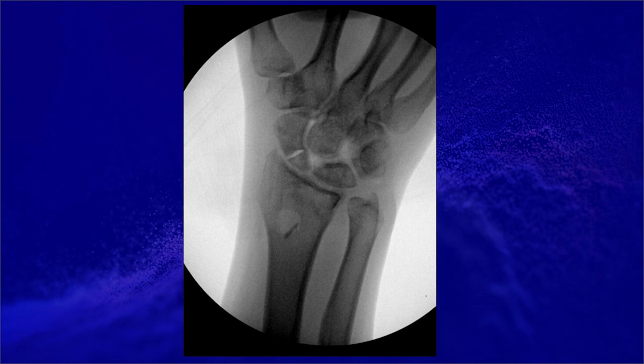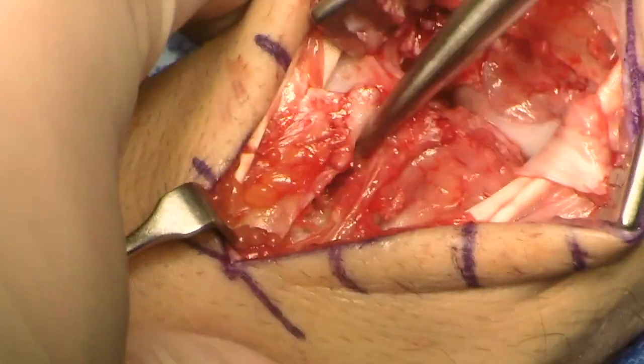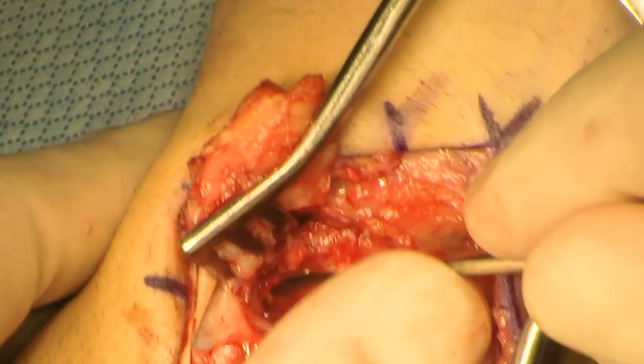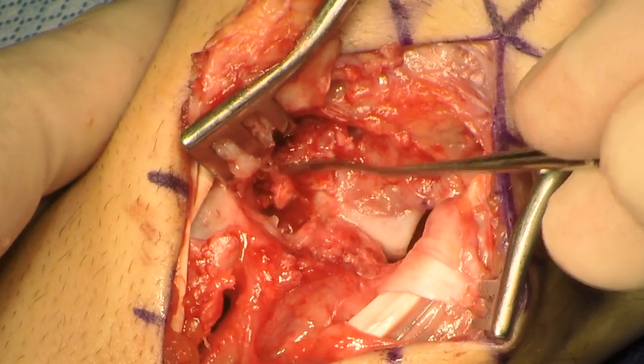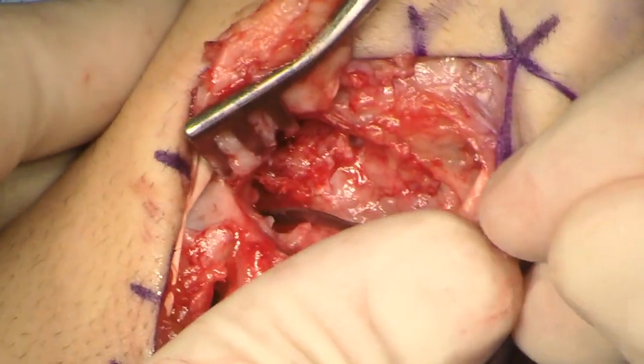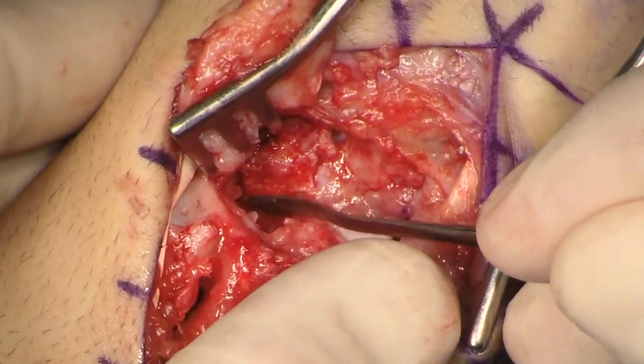There was a gap due to debridement of the cancellous bone. We have two options: make another cut with the sagittal saw to get a flat surface, or fill the gap with bone graft. In this case, I did not have enough graft length to take more scaphoid, so I elected for bone grafting. Distal radius bone graft was harvested through the third dorsal extensor compartment. The scaphoid was then packed with bone graft — it is very important to place bone graft in layers and compress it as much as possible to get as dense a graft as you can.